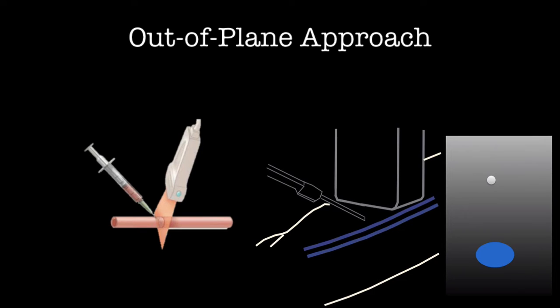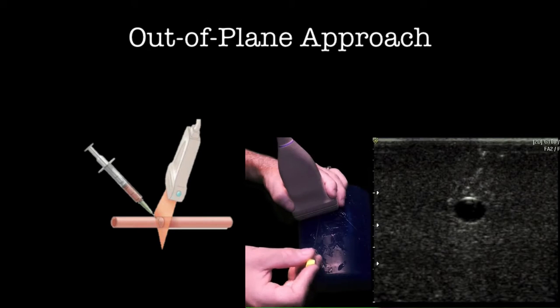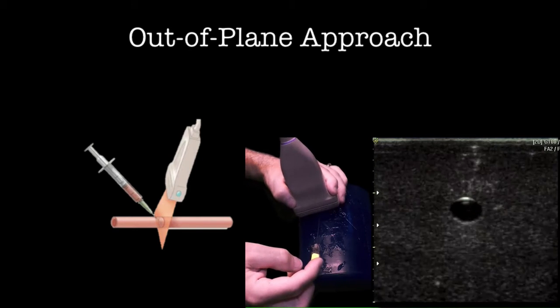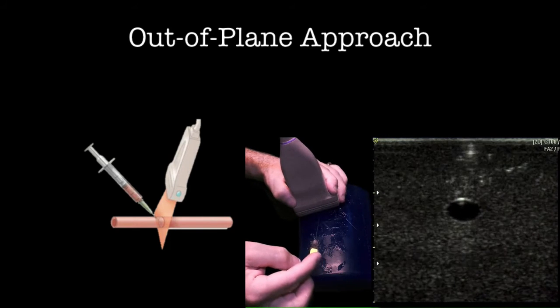The needle is placed under the long face of the transducer as close to the transducer as possible until the needle is seen at the top of the screen. The needle is then walked down to the vein.